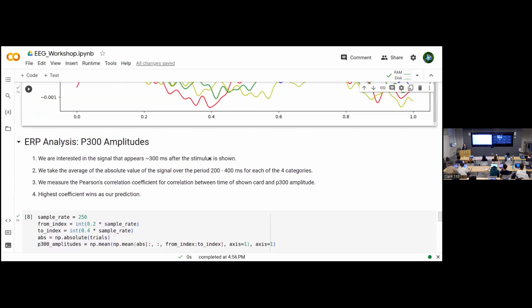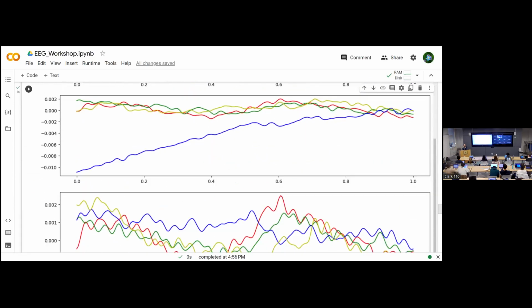Oh yeah, here's another pre-processing step that we weren't able to do in this workshop because of the lack of time we had for preparing it. For each of the cards, we have many segments, right? And it is possible that for one of those segments, or a few of them, you have some outlier reactions.